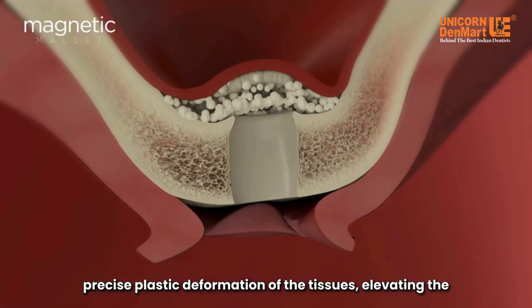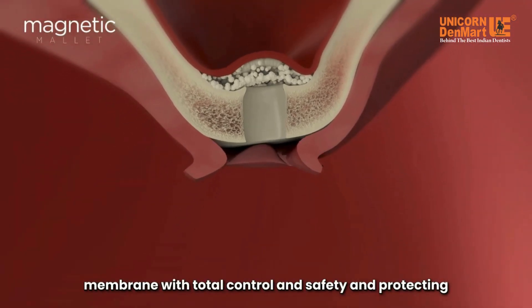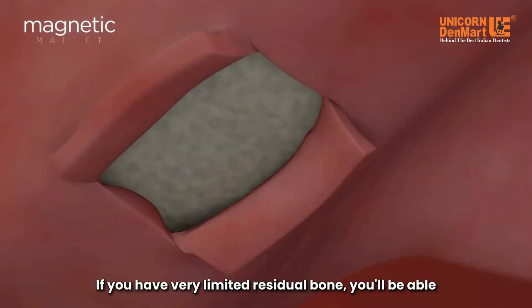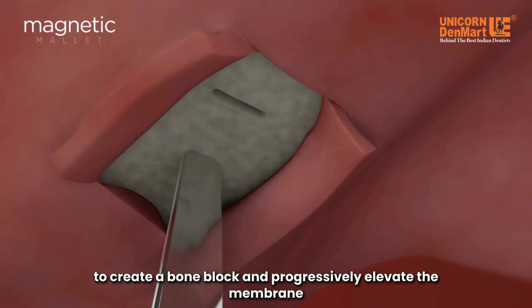The magnetic mallet will allow you to perform precise plastic deformation of the tissues, elevating the membrane with total control and safety, and protecting 100% of the native bone. If you have very limited residual bone, you'll be able to create a bone block and progressively elevate the membrane using the same level of control and safety.